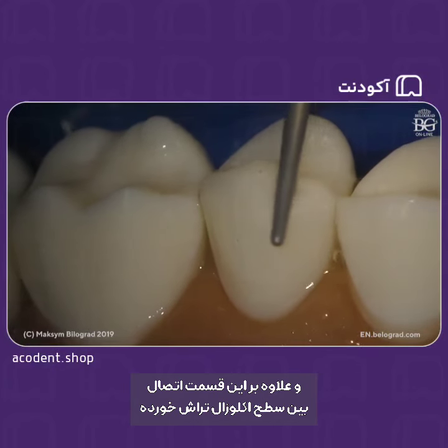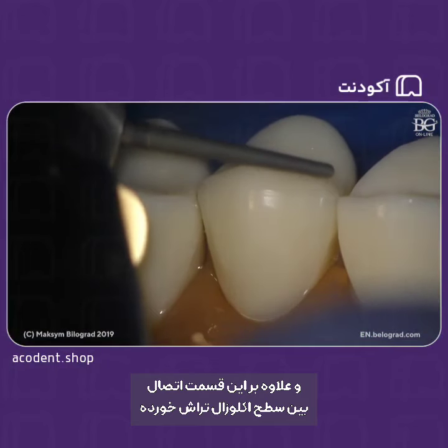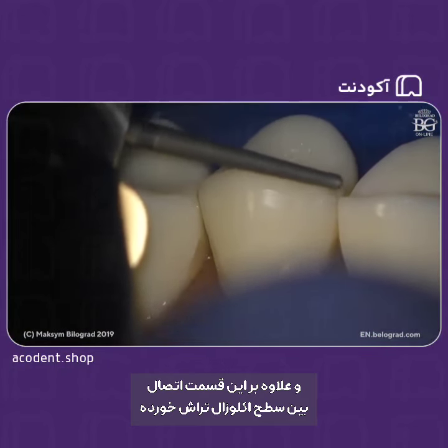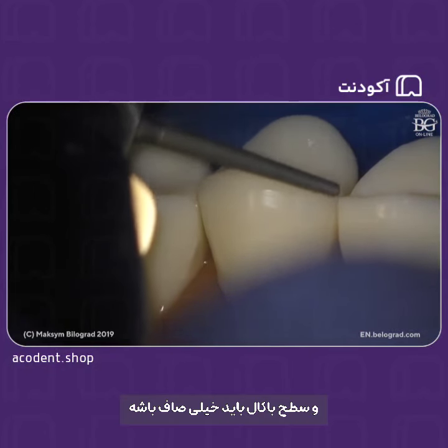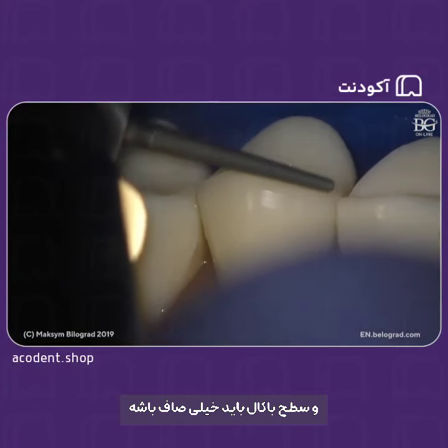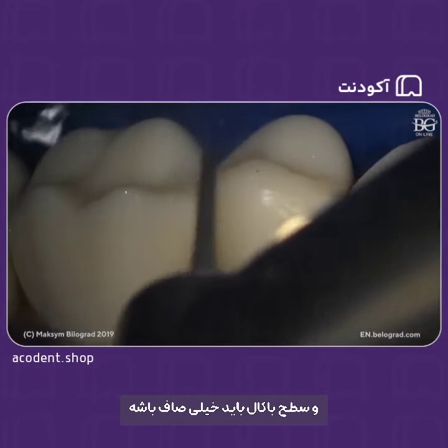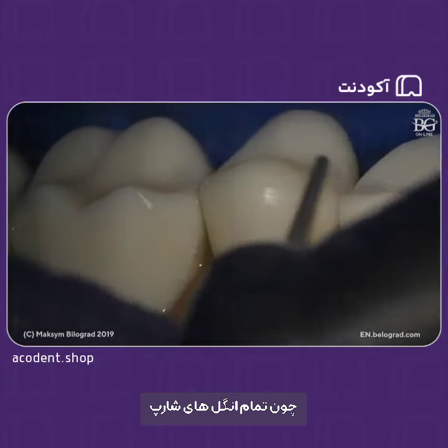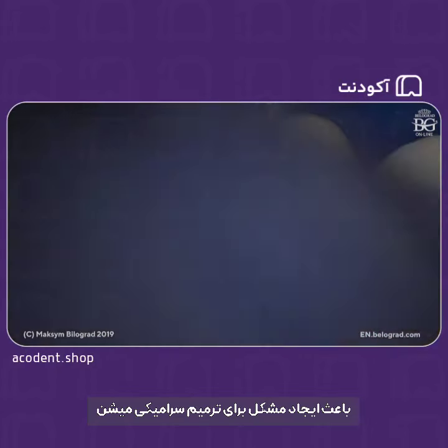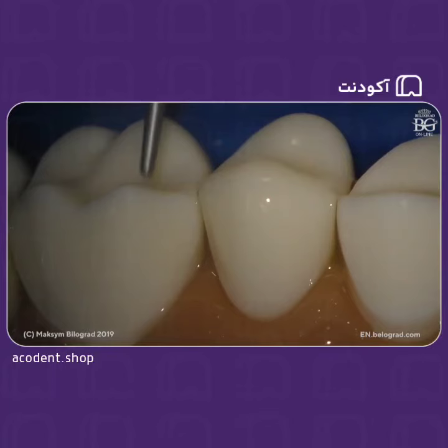And also this transition, this is the transition from prepped occlusal surface or tip of the cusp towards buccal surface. It has to be really also really smooth, because all sharp internal angles can cause problems for ceramic restorations.